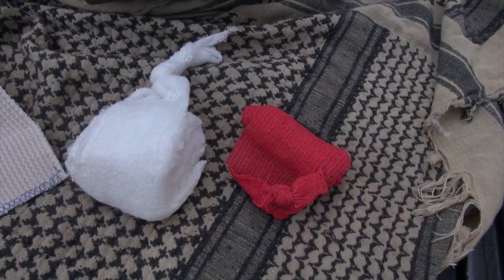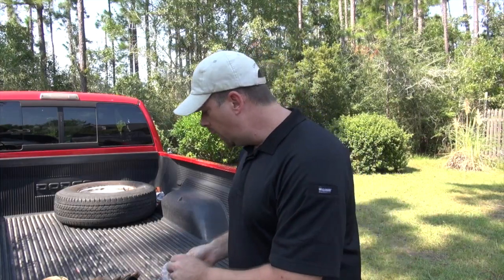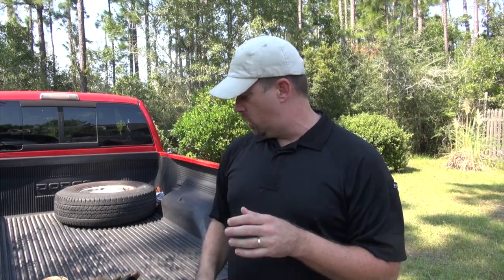I've got Coban, or what they like to call Vet-Rap. Vet-Rap is great for dressing wounds. If you want to get a little bit fancier and spend a little bit of extra money, you can get a pre-made pressure dressing.